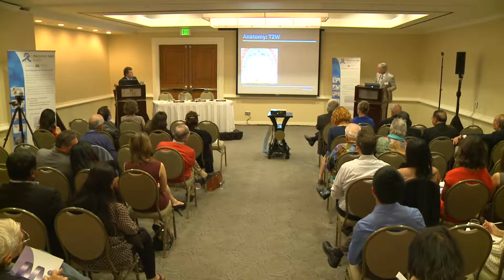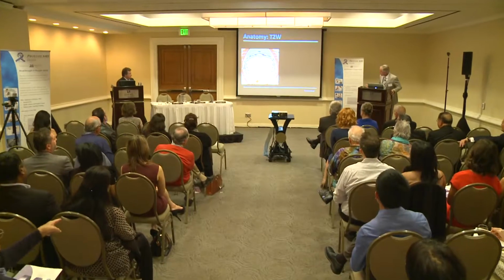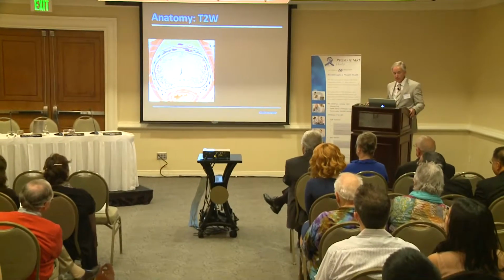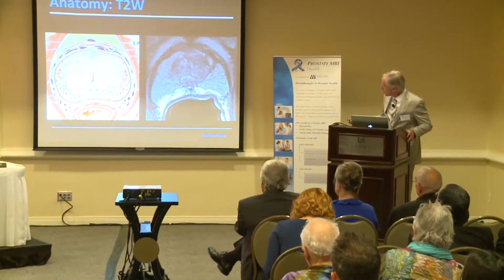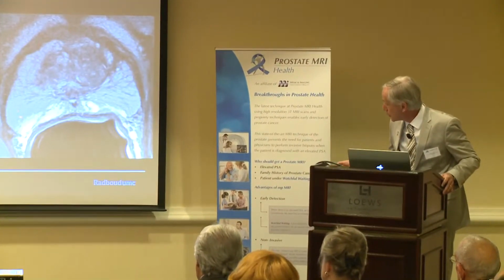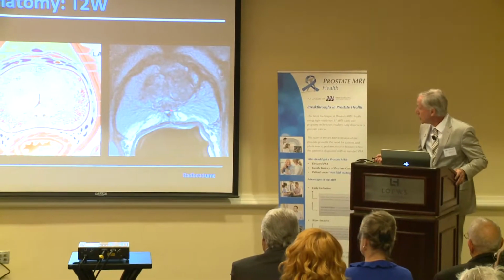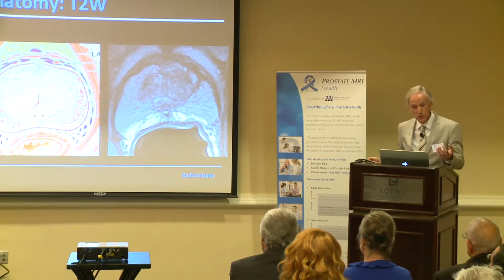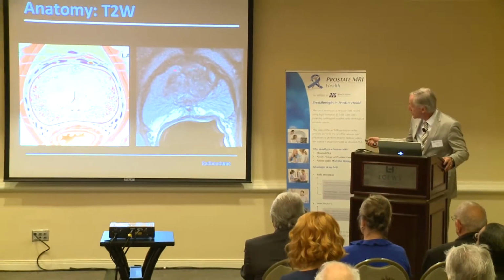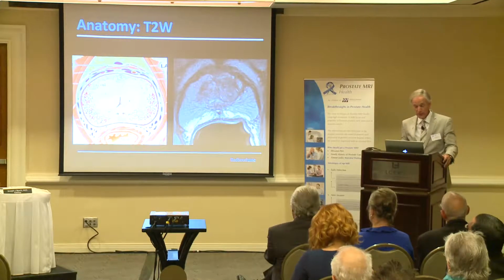Anatomy. This is an anatomical section through the prostate, and you can see very nicely the central part of the prostate, the transition zone. You can see the peripheral zone, and this is a beautiful image of the Netter Atlas. Now, it is not in color, but you can see that MRI almost beats this beautiful image. You can see the peripheral zone being white with the strands of fibrotic tissue. You can see the transition zone. In this patient, it starts to be enlarged because at my age it will enlarge due to benign prostatic hyperplasia. So you can see this image nicely matches this very nice, colorful anatomy.